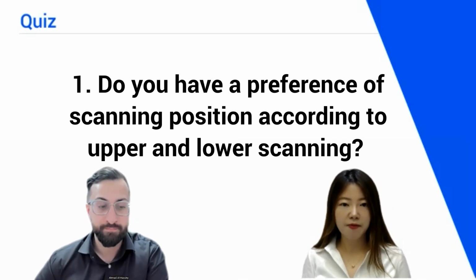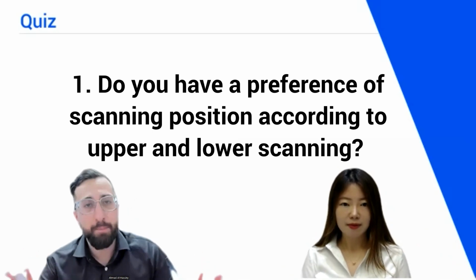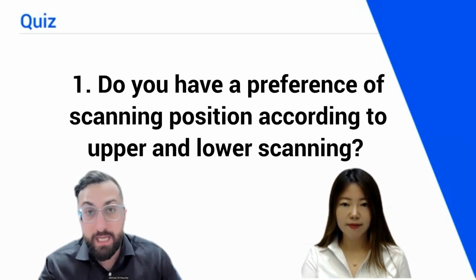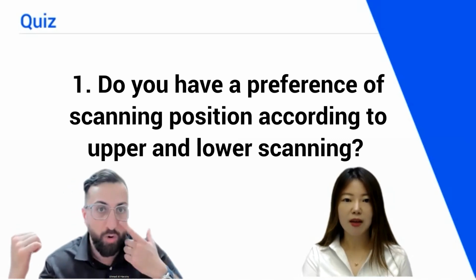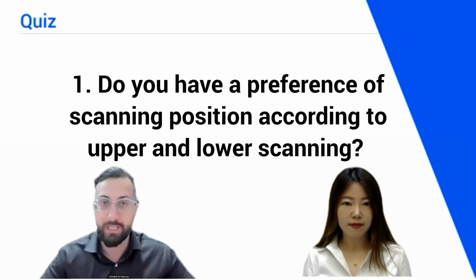That means even for upper and lower, you stay with the same position, right? Always the same position. And more importantly, about positioning, that I really want you guys to conceptualize: I've seen some dentists who don't get a scanner cart and they have their laptop on their desk or something like that. And ergonomically, that's a terrible position. You know, you're looking over your shoulder to scan.